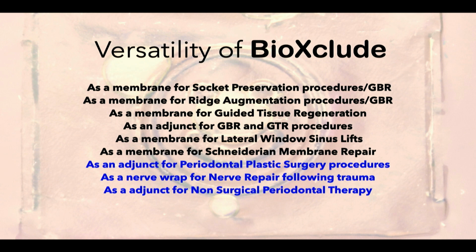Yeah. I've used it on a couple of extraction preservations. Now, it'll be stuck down. It preserves the extraction once I go to suture. You ever get that? Do you think it's a problem? I don't think it's a problem.